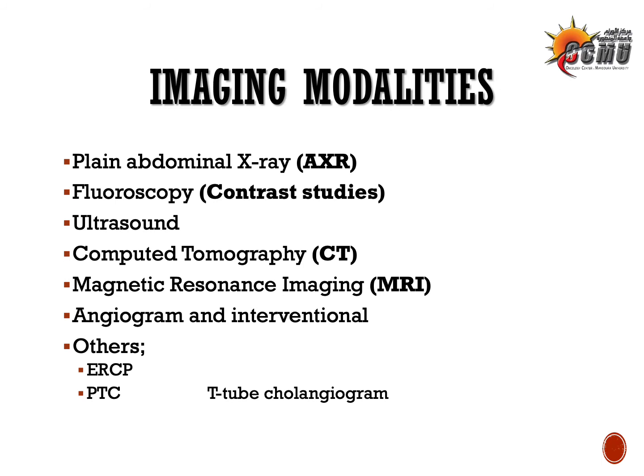And sometimes we add a contrast material, and in this instance, it will be called an X-ray with dye or fluoroscopy, like the ones we do for upper GI: barium swallow and meal for esophagus and stomach respectively, barium follow-through for small intestine, and barium enema for the large intestine. The X-ray with dye will be discussed in another lecture, inshallah.